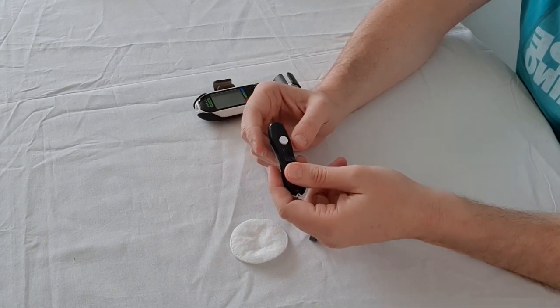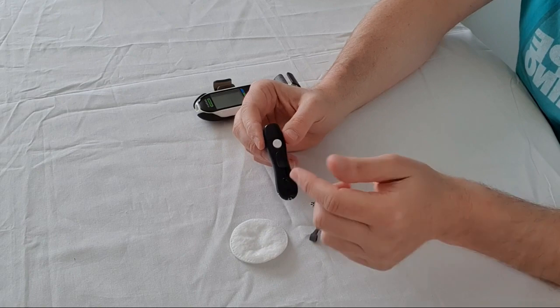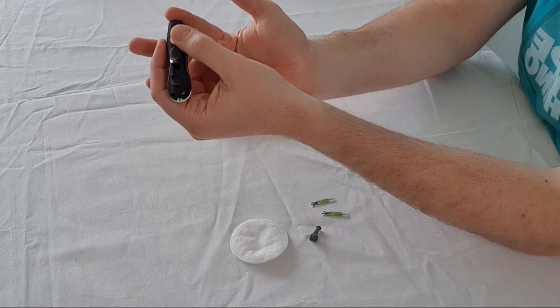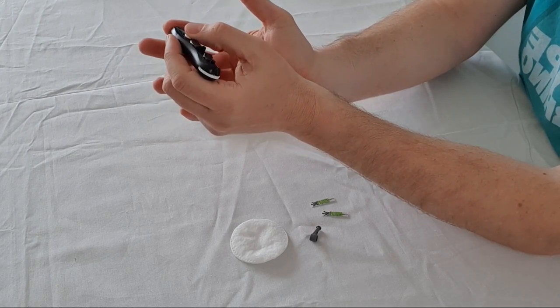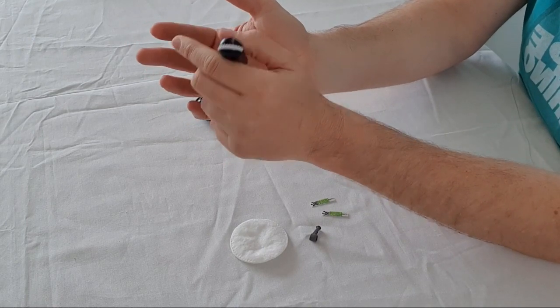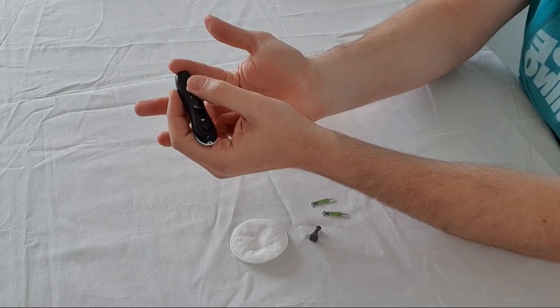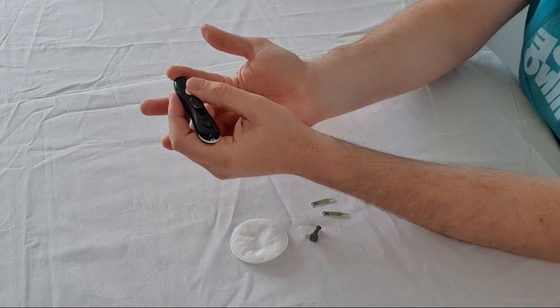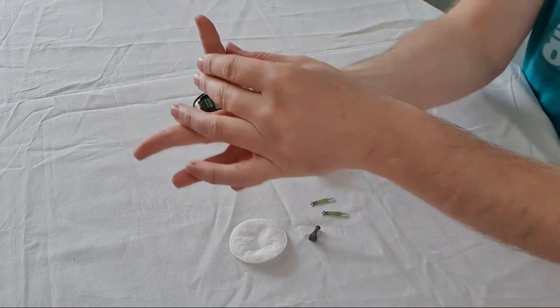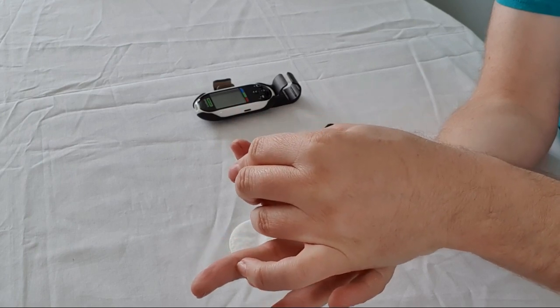Now that the lancet is loaded, to take the blood test you press this button here and that shoots the needle out and into your finger. I advise you use the side of the finger. If you use the front of the finger there are a lot of sensitive sections there, so penetrating it will hurt a lot more. Doing it on the side won't hurt as much. Press reasonably hard and then press the white button so it goes into the side of your finger.